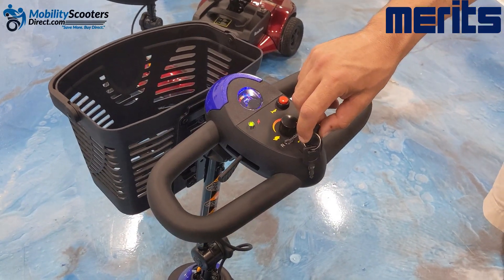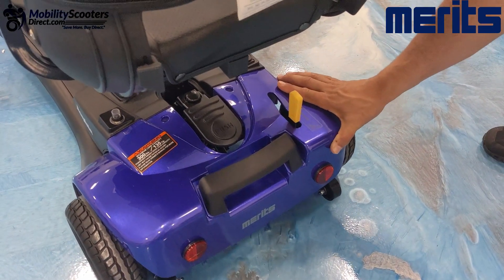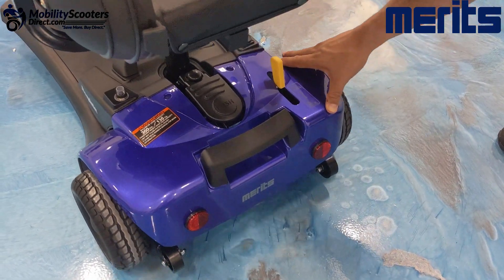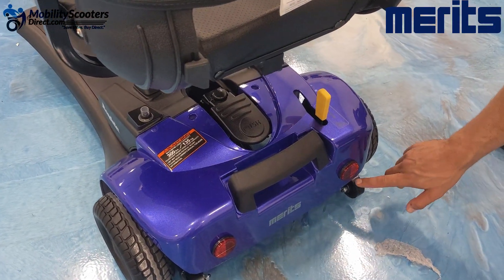It has a rather loud horn, which is a high-pitched beeping sound. You can disengage the automatic braking system by tilting the lever forward as shown here, and then you can push it manually. You do need to put it back into the locked position, or else the scooter will not work.